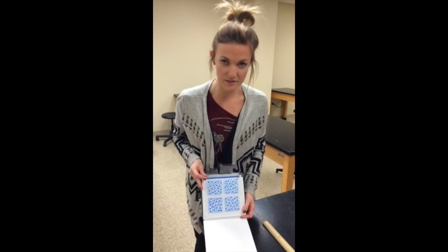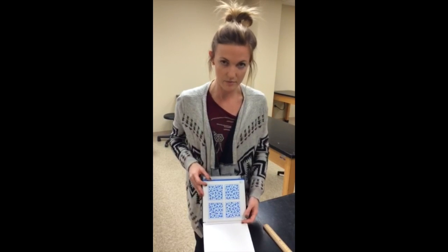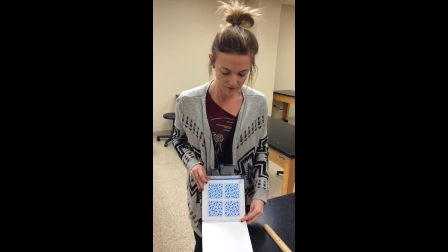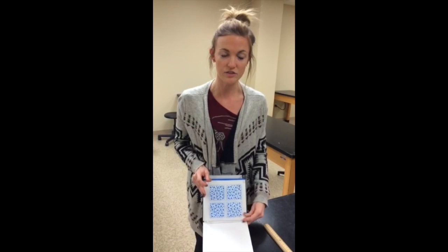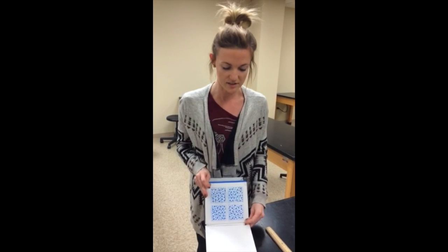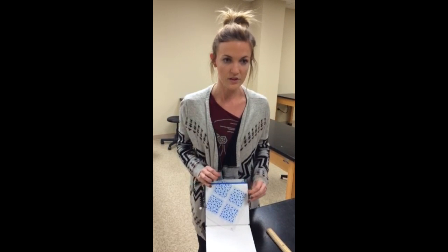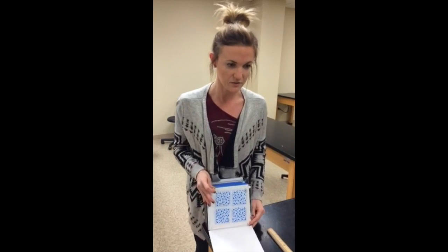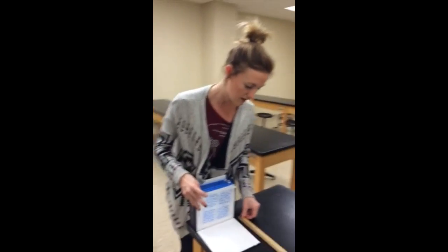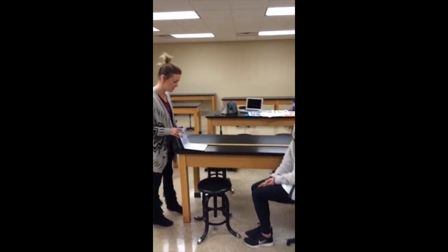Okay, so here you can see we have our plate held against the white background, which helps our patient be able to see it better. And I'm going to turn it in between each trial, and when I'm turning it, I'll have the patient close her eyes so she cannot see which direction the stimulus is coming out. So we're going to do an example at 1 meter away, having our patient sitting exactly 1 meter.